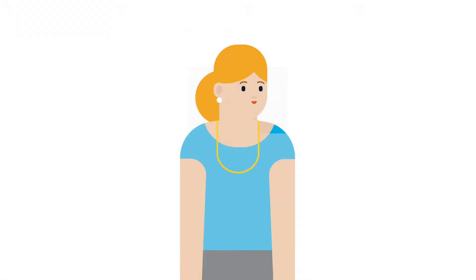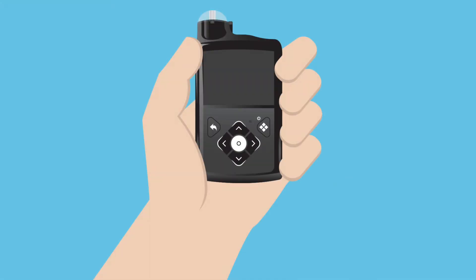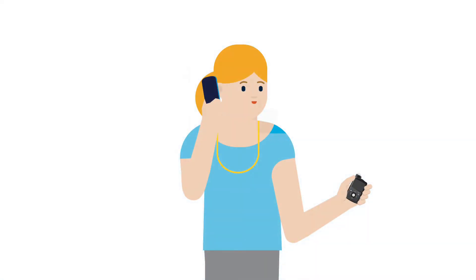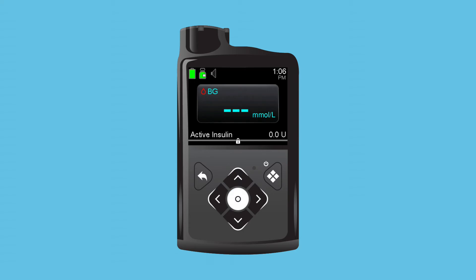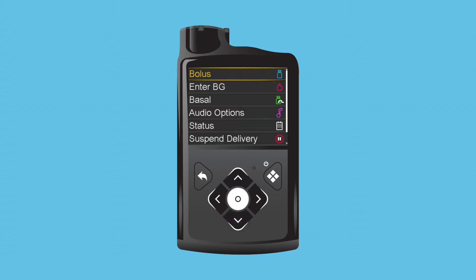Ed, Clara's co-worker, stops by to see what she is doing. As they talk, the pump's screen goes dark and the pump goes into sleep mode to save battery life. As Ed leaves, Clara looks down and sees the dark screen. She presses one of the buttons on her pump to turn the backlight on and sees the home screen appear, but notices a small lock at the bottom. She presses another button and the unlock screen appears. Clara presses the button that is highlighted on the screen to unlock the pump, confirming she is reading the screen and the button presses are not accidental.